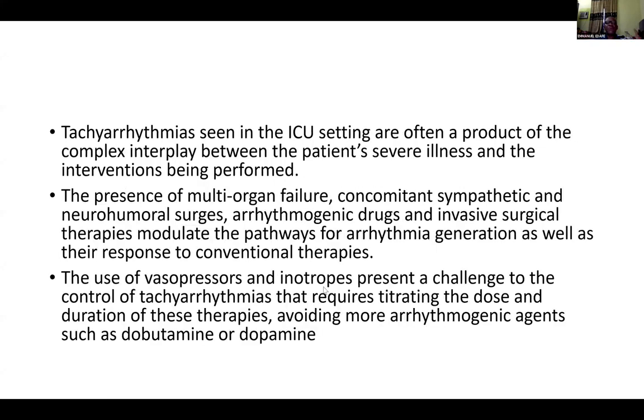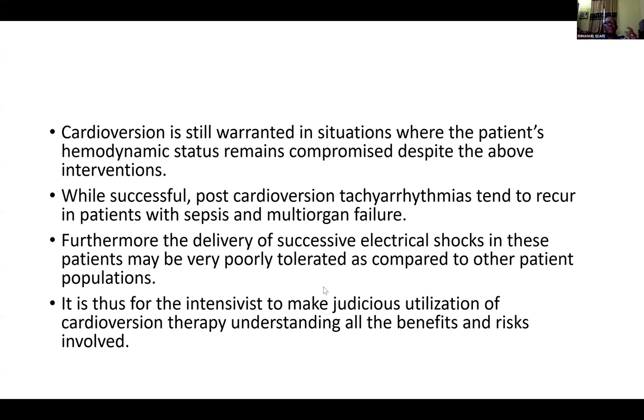Okay, so the ability to recognize is very important. So that is ECG, and also to recognize each of these rhythms and know when to apply cardioversion or when to apply defibrillation is very, very important. And the earlier we do it, the more success we give to that patient in terms of survival, because the more we delay, the less chance of having success for such a group of people.